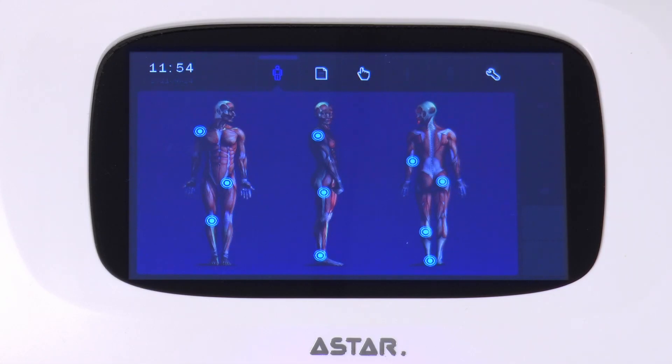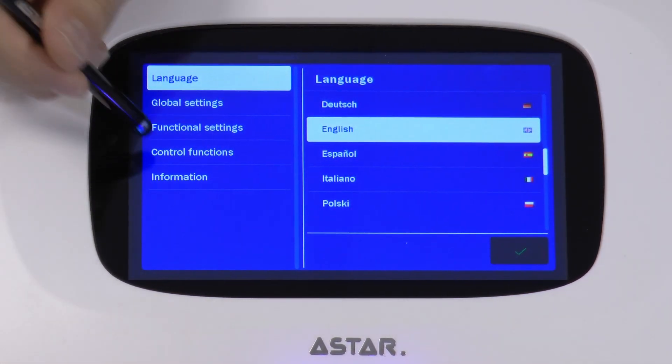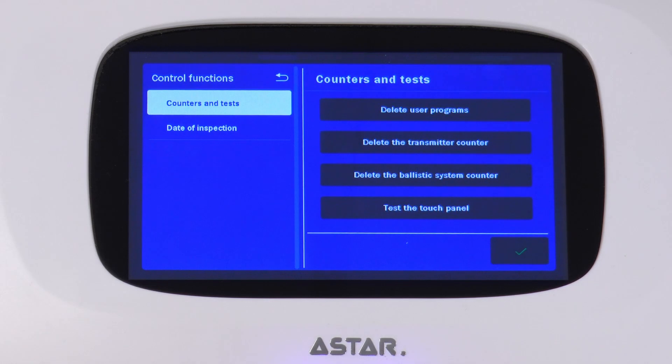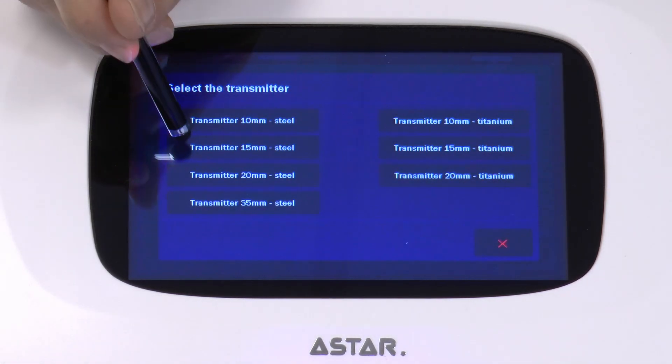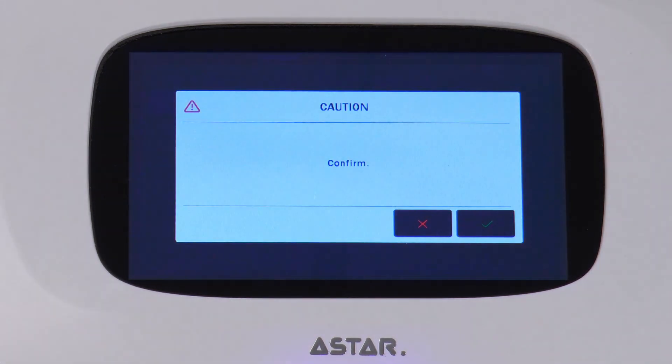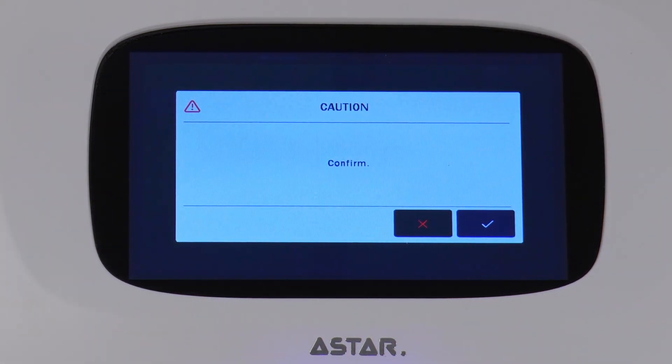Turn on the device, enter the Setup mode, Control functions, Counters and Tests. Choose to reset the transmitter counter and indicate the transmitter you have just replaced. Confirm deletion with the OK key. Now you can start using the device.